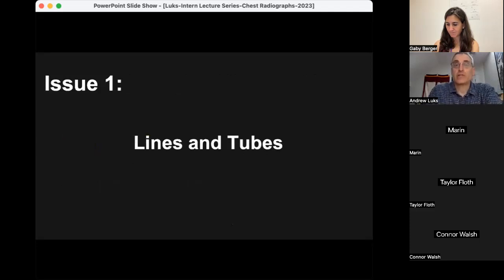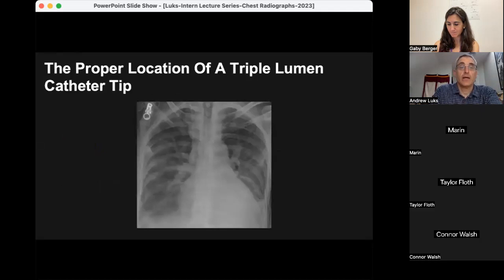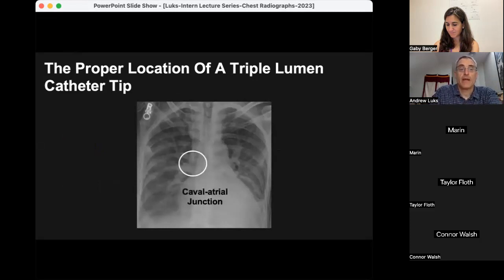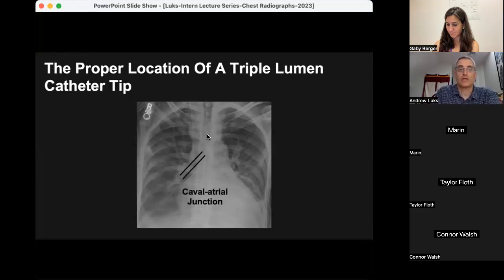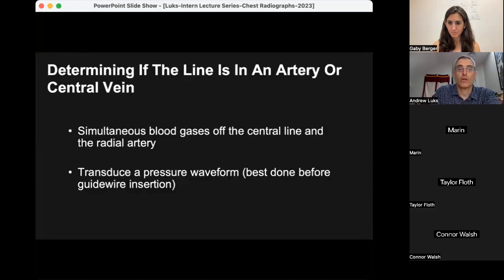One of the things that will occupy a lot of attention this year is checking radiographs to assess whether a line or tube is in the correct position. For triple lumen central venous catheters, you want the tip at the cavoatrial junction — where the superior vena cava meets the right atrium — typically located where the right main stem bronchus crosses the right side of the heart shadow. This is where you want a central venous catheter from the subclavian or internal jugular position to end. A femoral catheter won't come up this high, and a Cordis catheter used for volume resuscitation is too short to reach that location. For dialysis catheters, the tip should be roughly in the same location.